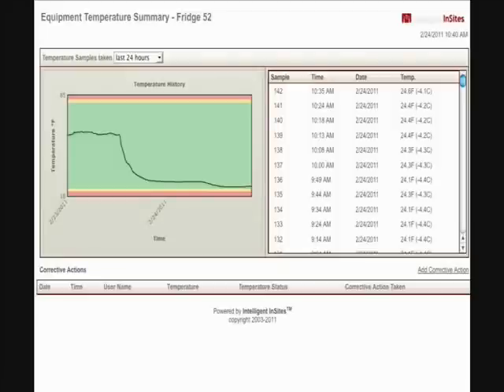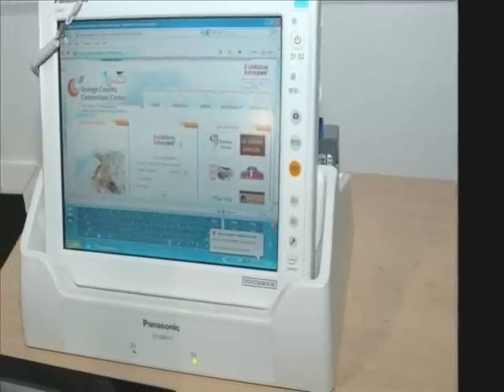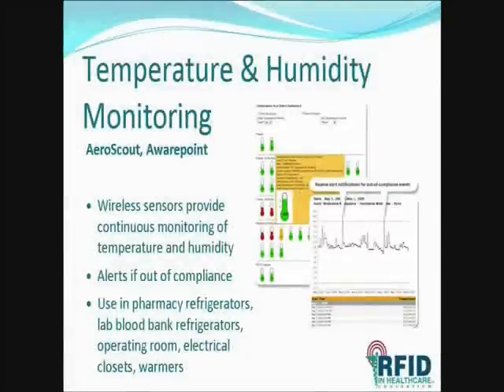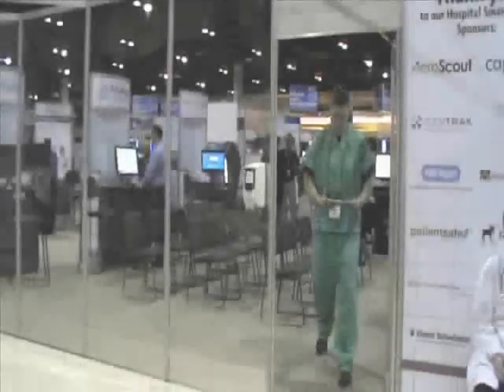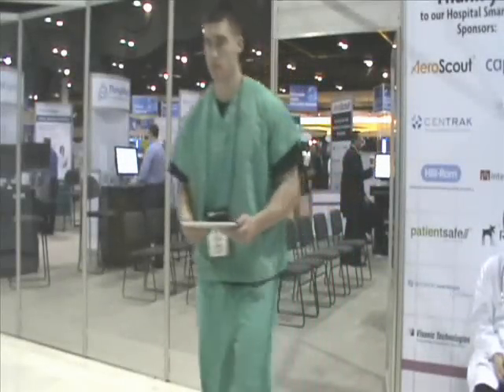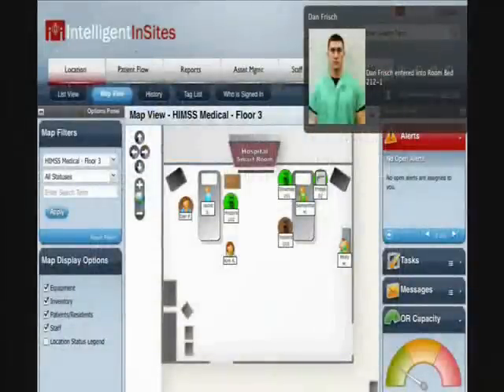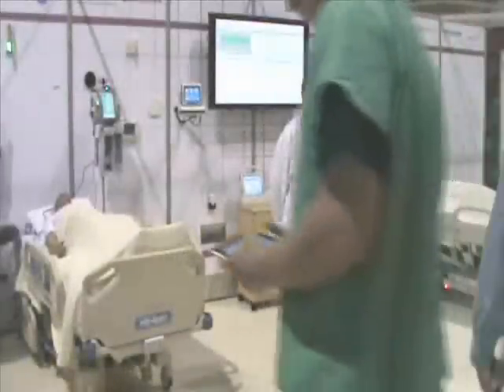This information can be seen on the large monitor or the portable tablet. It triggers alerts to hospital staff, or it can be documented, revealing trends required by regulatory agencies like the Joint Commission. As you can hear, because my assistant entered the patient room without washing his hands, an alert was triggered. In this case, I chose an audio alarm.